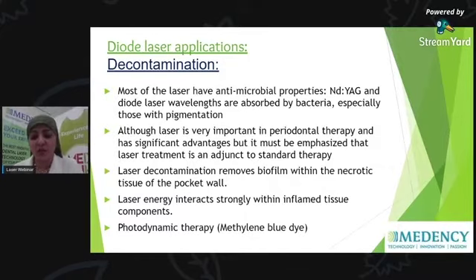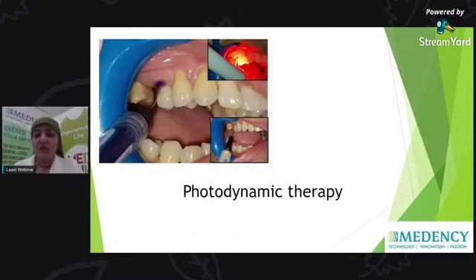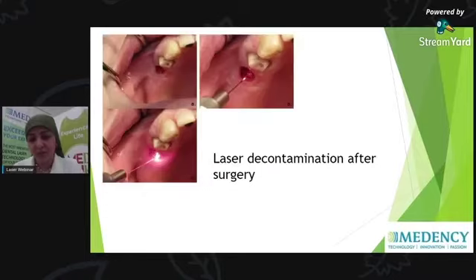So you can use methylene blue dye, or you can use betadine also, it's red in color. Here, this is a photo I uploaded from the internet. As you can see, this is a photodynamic therapy. The operator is injecting blue dye, methylene blue dye in the sockets, and then he activated his laser.